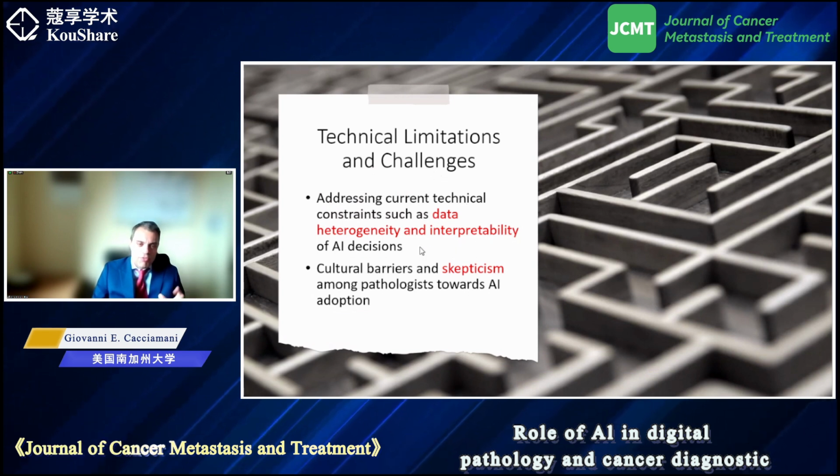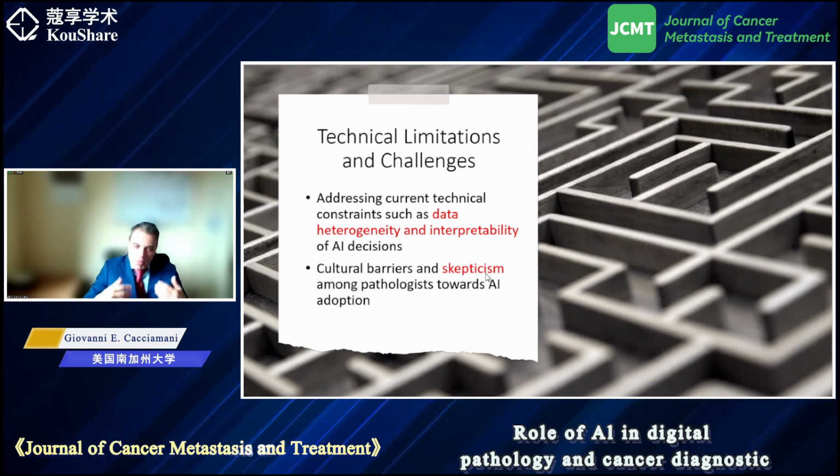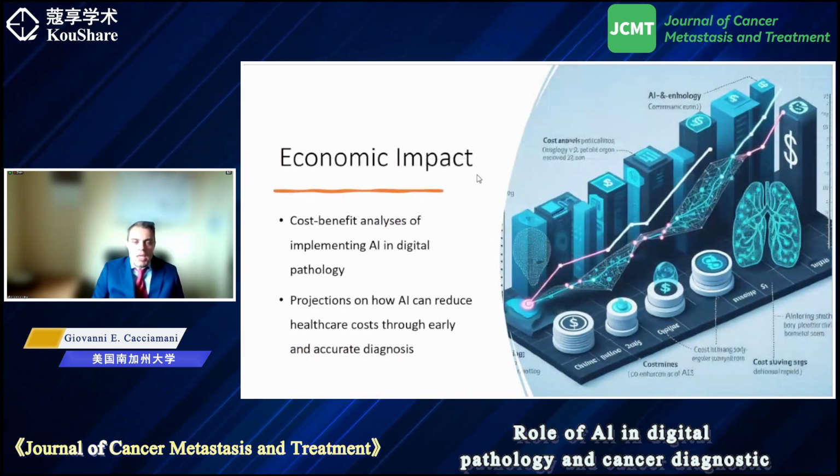So the interpretation of the data is still to be properly defined. And then, not trivially, honestly speaking, it was true also for robotic surgery, there is skepticism, particularly, let me say, among the older generation of pathologists. They are used to a certain job, they rely on their skill, and it could be difficult to introduce a system that, not by chance, is currently more appreciated by the younger generation.